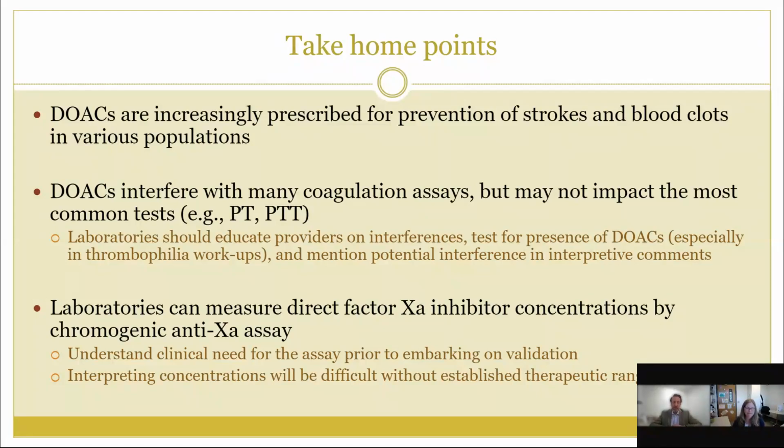So it could be some amount of work to do that then. Yeah, I think so, but in the context of lupus anticoagulant testing, it probably has the strongest argument of being clinically very important to know if a lupus anticoagulant is present, because it could change how the patient is anticoagulated, potentially for their lifetime. Okay, that's important.